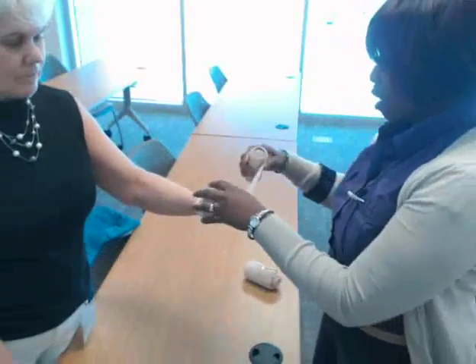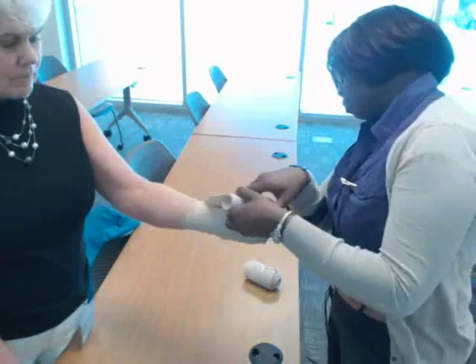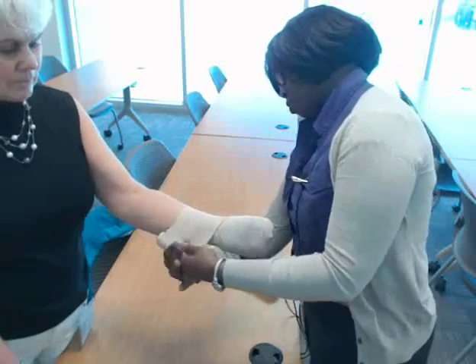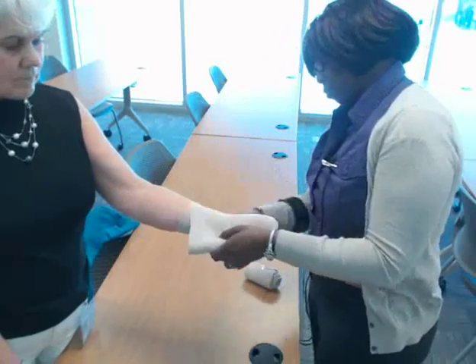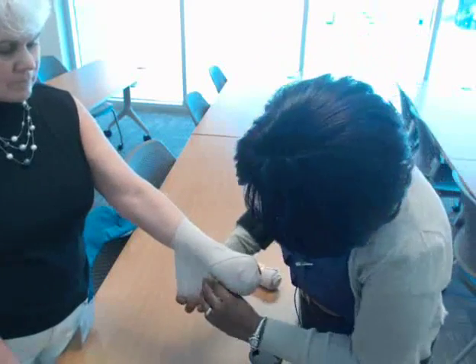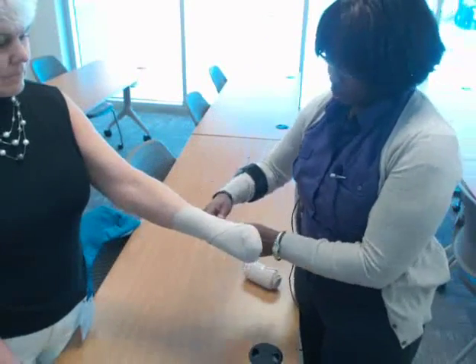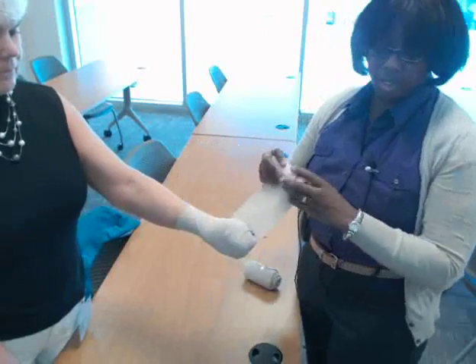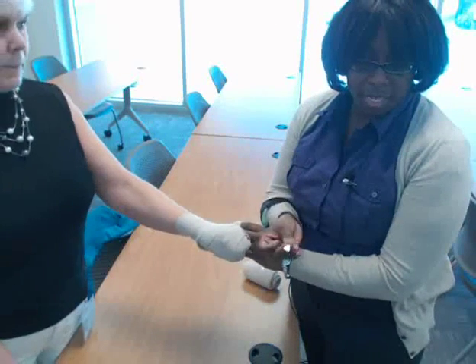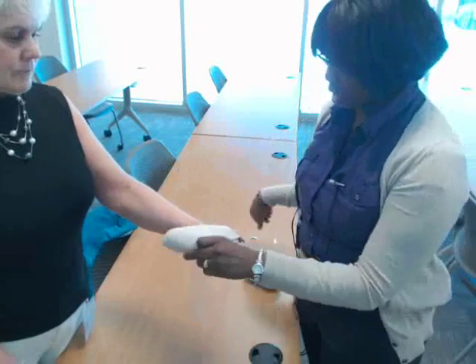After doing that you want to go into the figure eight turns — up, down and come back around. Up, down and come back around. You can see the figure eight pattern starting to happen right here. Typically we like to secure our bandages with tape, as opposed to the little clips that come with the bandage. That's for better safety for your patient so they don't get stuck by those clips.